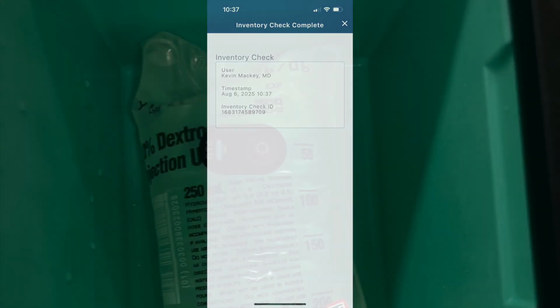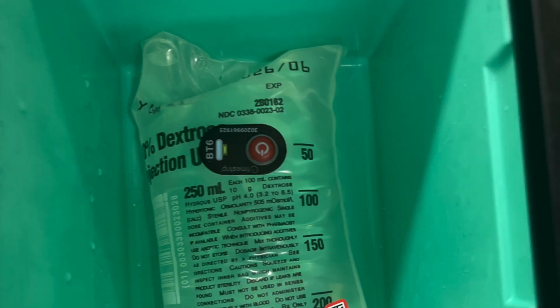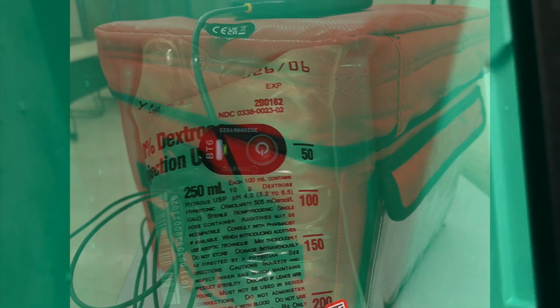Now, what if that indicator is not white, but is now blue in that box? That means that that blood or D10 has gotten warmer than 6 degrees Celsius. At this point, at your convenience, go down to the EMS division, connect with Taco. He has more of these stickers that he will activate, and he will attach it to the front of your D10. And we'll take care of this on the other side. This is the most important part of this, is making sure these coolers keep that bag at least 6 degrees Celsius or less. All right, then you're good.